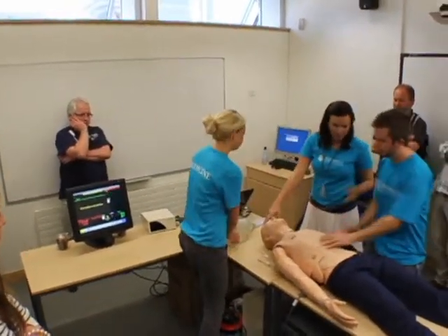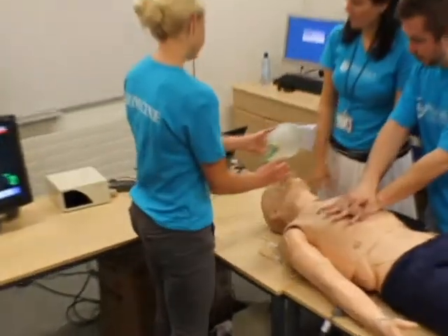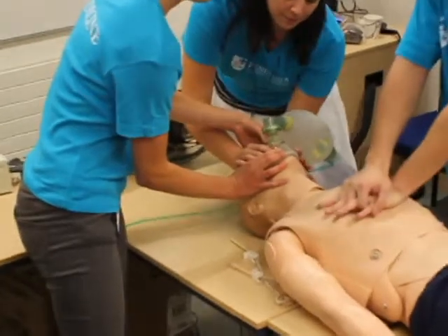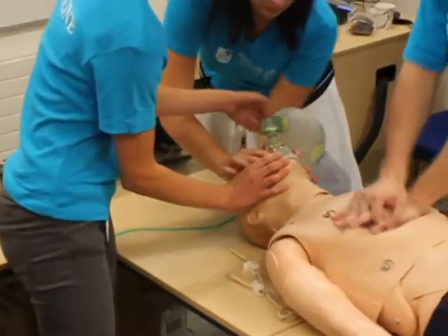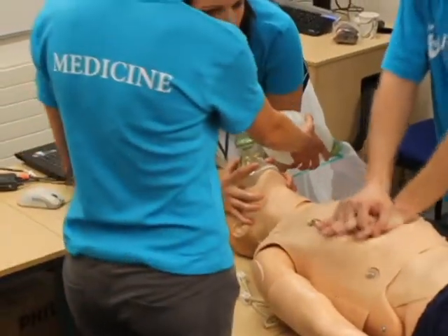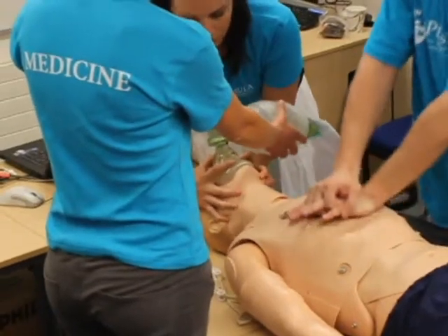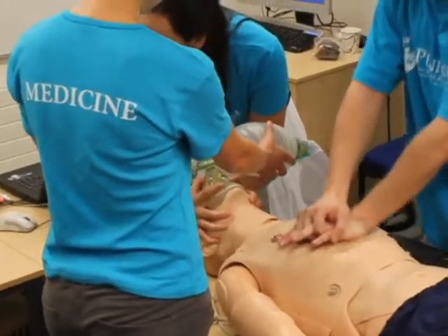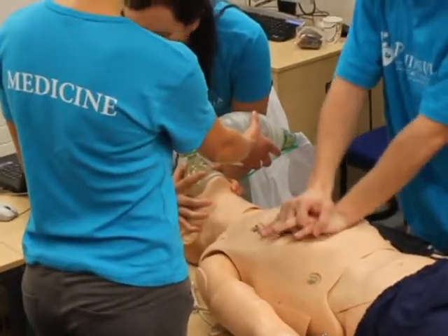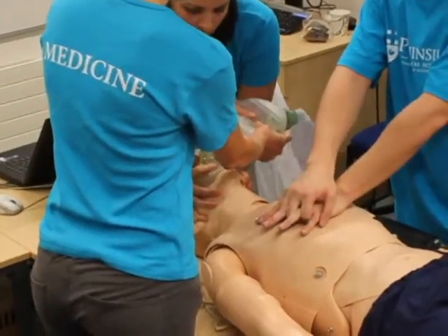Can you do a pre-cordial thump please? And then come back and assess his expressions. What we've got here is a crazy, chaotic electrical pattern. That regular heartbeat disappeared. That's a cardiac arrest — that's ventricular fibrillation. His heart is not pumping, there's no blood going around.